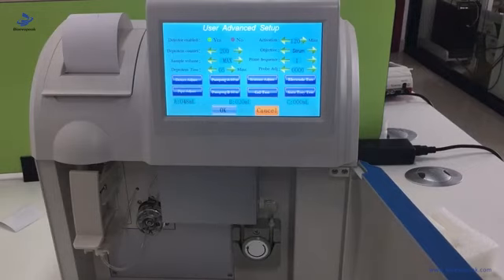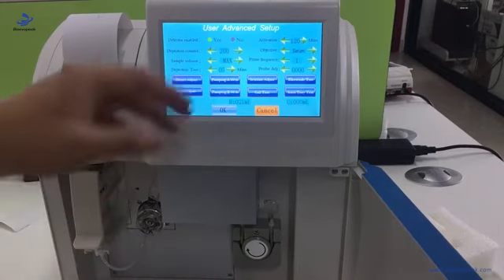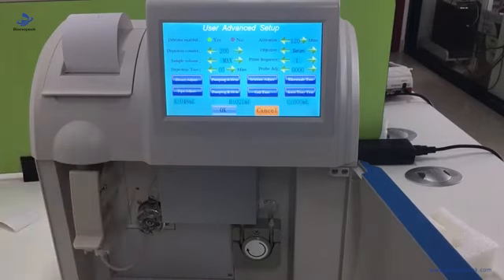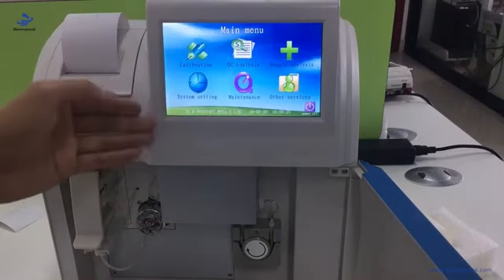When using this function, you can check at the distribution valve to see if there is liquid passing through the pipe. Now we can go ahead and do the calibration.